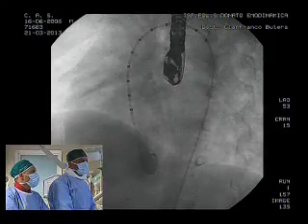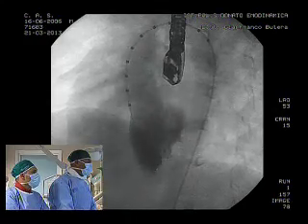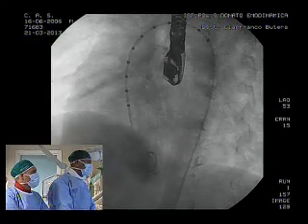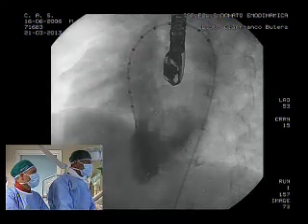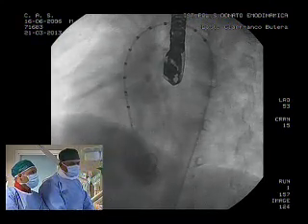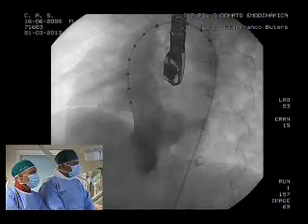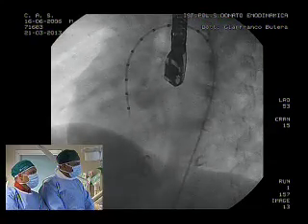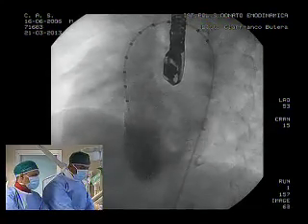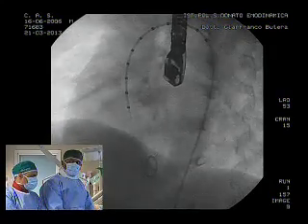Ziad, I would use an ADO2. I have seen now the VSD, and it is perfect for an ADO2, 6 millimeter. Very easy to do. ADO2 6 millimeter? No block. Okay. And I hope we can push a little bit for bigger devices in future instead of the new VSD device. All right. I'm sorry to say.